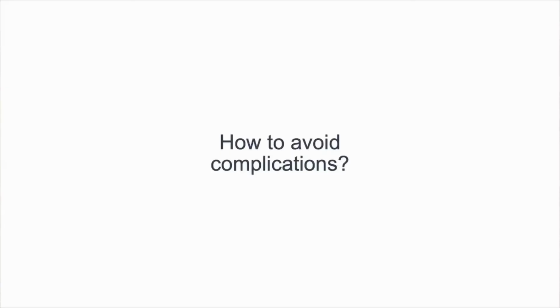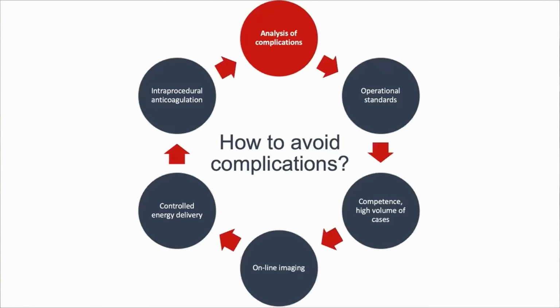How to avoid complications? This is a complex and never-ending system that is based on analysis of complications, incidents, mechanisms, and diagnosis and treatment of these complications, operational standards, focusing on ultrasound-guided venipuncture, transseptal puncture, catheter introduction, and so on.